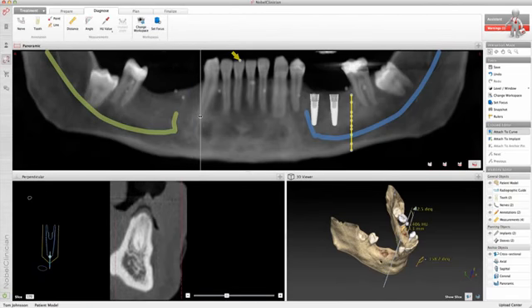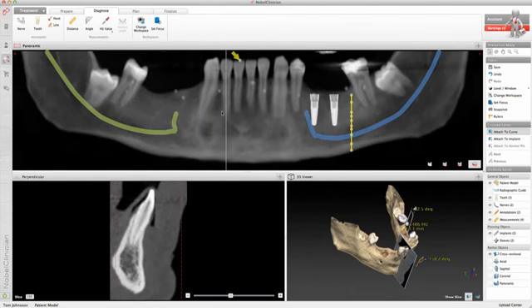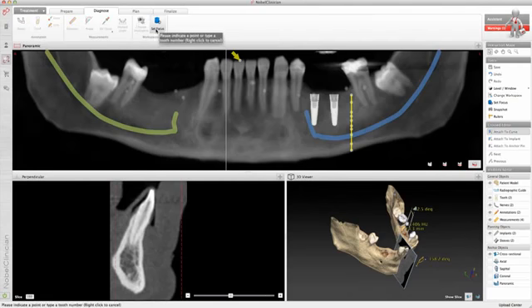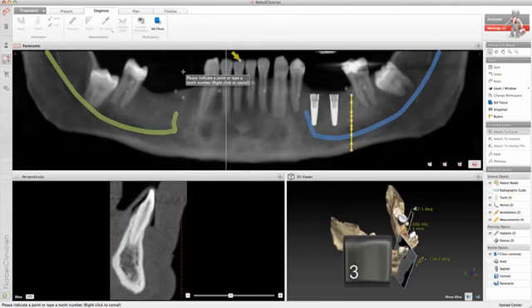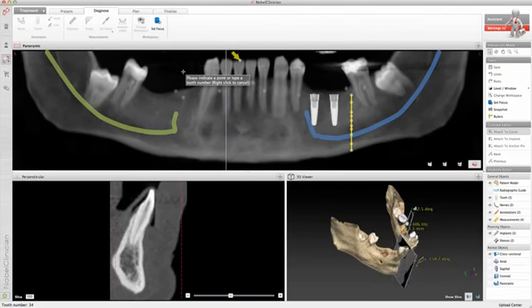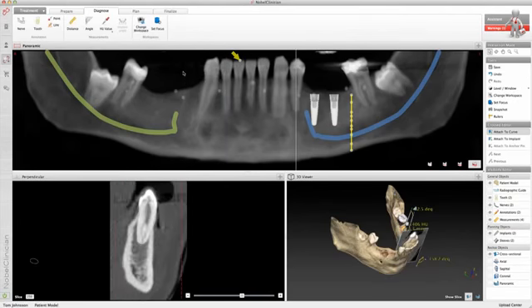You can also use the set focus action to position the cross-sectional reslice immediately at a certain tooth number position. To do so, press the icon, enter the tooth number on your keyboard, and press the Enter key. The reslice will jump to a position in the neighborhood of this tooth number position.